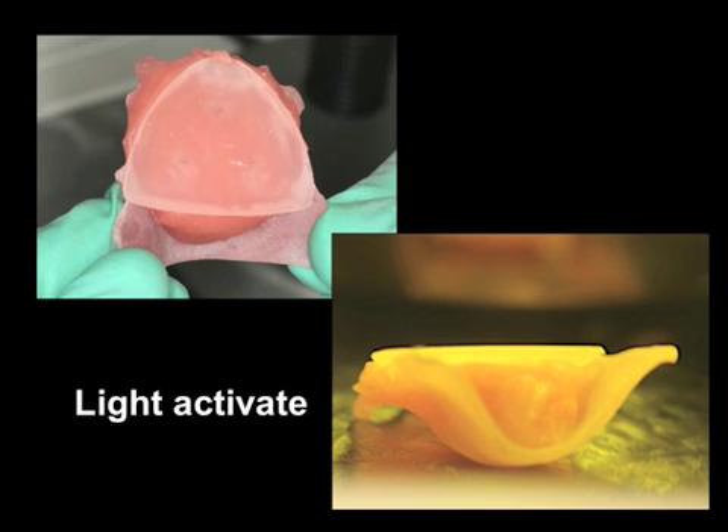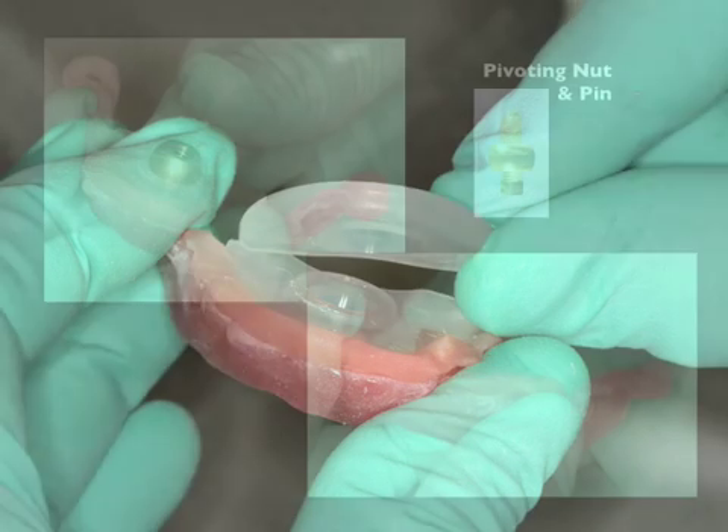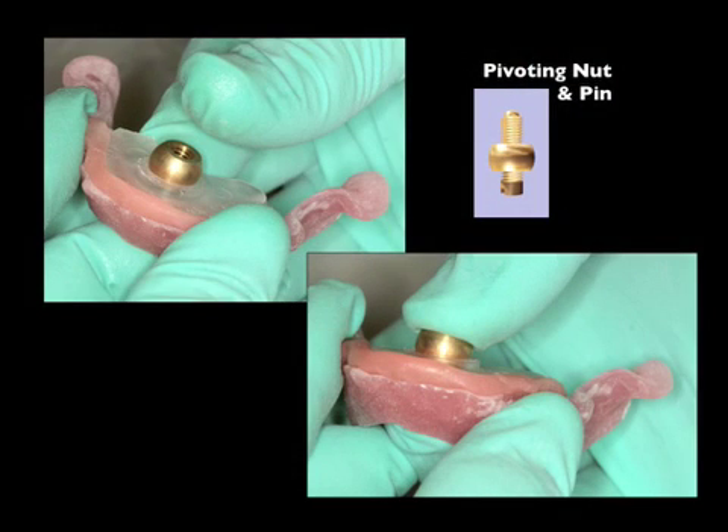We will now light activate. Once completed, we will remove the paralleling snap and then place the pivoting nut without the screw. It is important to understand that in order to place the pivoting nut, you must use finger and thumb and compress firmly for it to go directly into the socket — it is a friction grip. Once this has been completed, the pin can be placed into the nut.